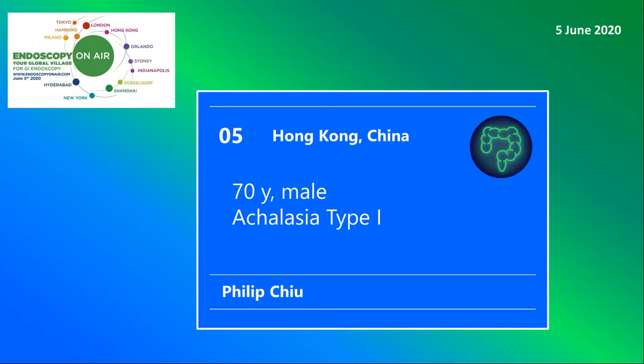Welcome to Endoscopy on Air. Watch Philip Chu treating a 70-year-old patient with achalasia by POEM.